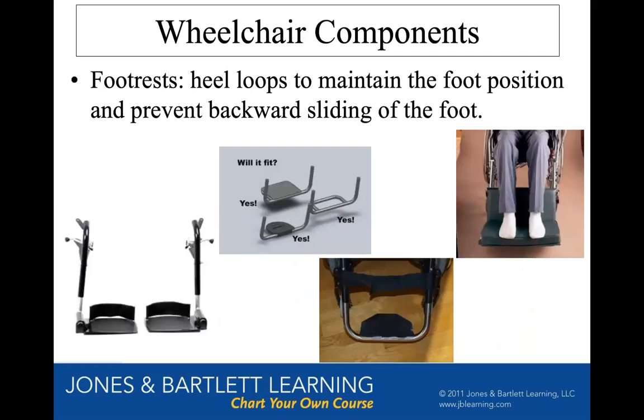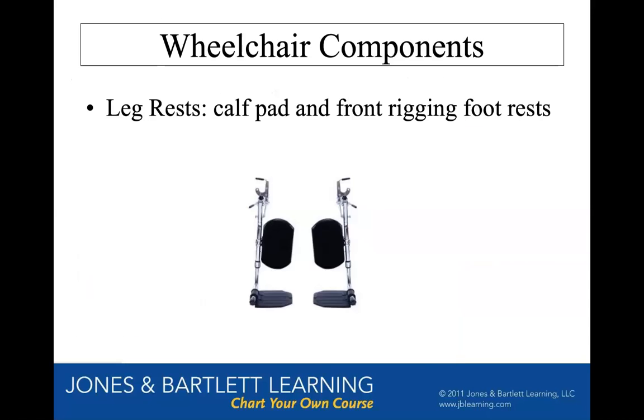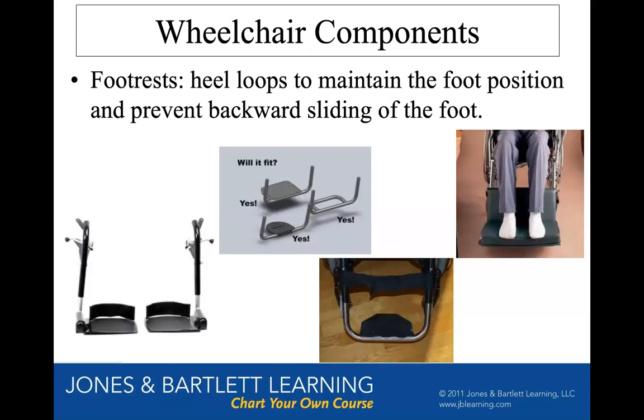Some will have not a calf pad, but a heel loop. So instead of the calf pad to prevent your leg from falling off the leg rest, they'll have a heel loop that'll go across the back of your shoe or the back of your ankle.